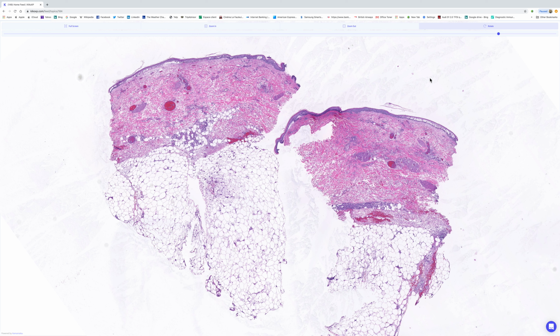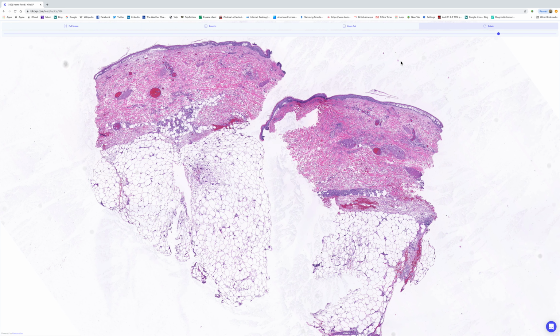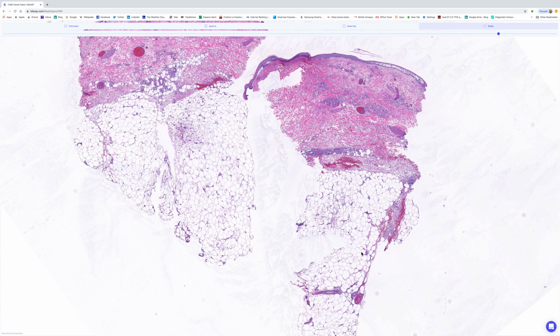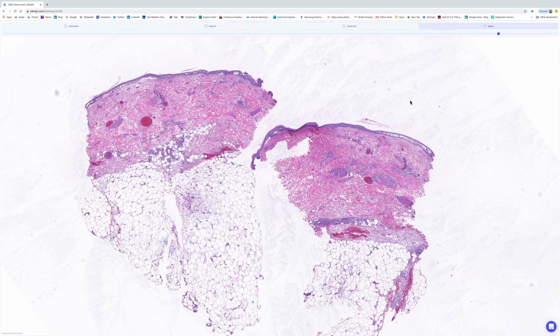And this is an absolutely beautiful example of Fusariosis, which was shared with me very kindly by Dr. Vicktoryia Kazlouskaya of Pittsburg University, and we're looking at it on the Kiko platform. And at slow power or scanning magnification, the features are very dramatic. The vessels in the dermis and going down into the subcutaneous fat are intensely dilated and congested, with a surrounding marked dermal edema.